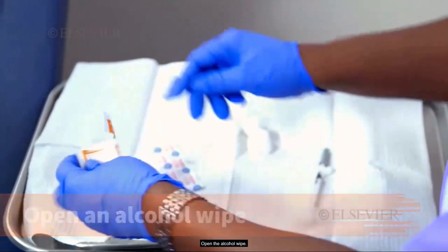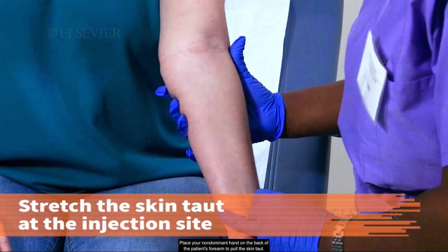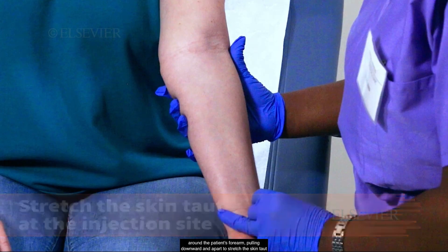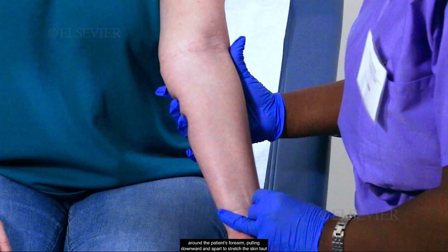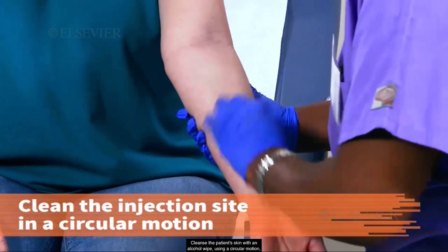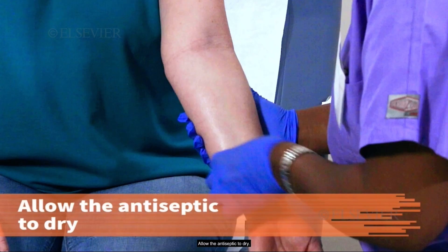Open the alcohol wipe. Place your non-dominant hand on the back of the patient's forearm to pull the skin taut. Another option is to wrap your thumb and the first two fingers of your non-dominant hand around the patient's forearm, pulling downward and apart to stretch the skin taut at the location of the injection. Cleanse the patient's skin with an alcohol wipe using a circular motion, moving from the center outward and creating about a two-inch area. Allow the antiseptic to dry.